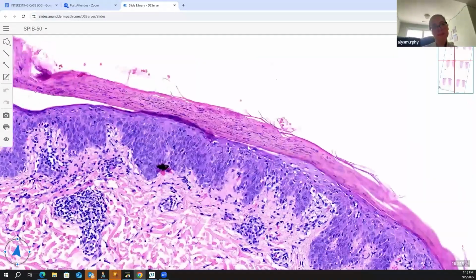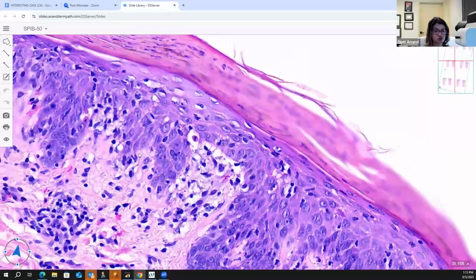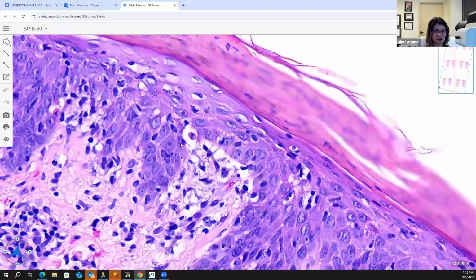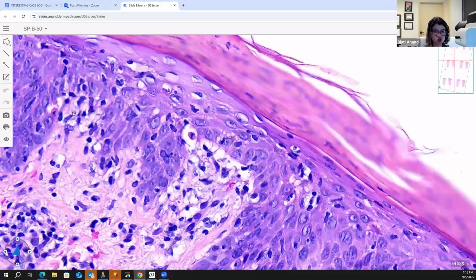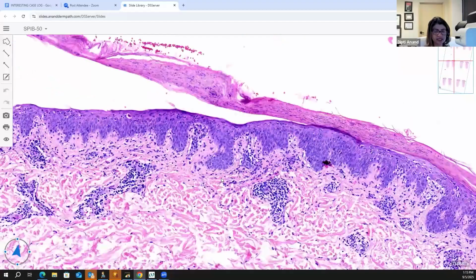The lymphocytes in the epi, and vacuolar alteration, which you only use when we are talking about hydropic degeneration. Vacuolar alteration means the cell death has begun at the DE junction by the vacuoles, which also have the necrotics. And there are no lymphocytes in here. They are true holes because it's vacuolar, but there are no lymphocytes in the holes. You get it?